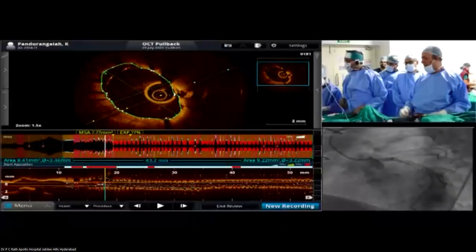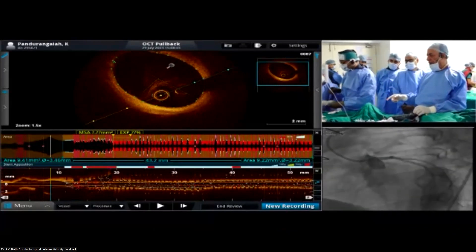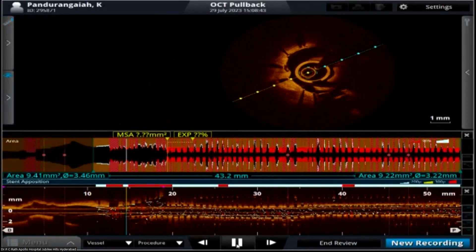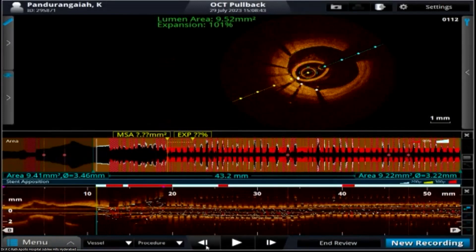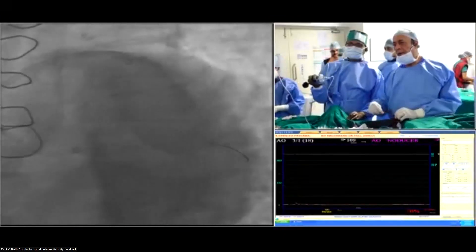Can you show the OCT imaging, please? We believe the patient was stable for this maneuver. In the OCT, you're saying the distal stent is nicely opposed, but just near the ostium, there is poor apposition. Just show the OCT image very clearly. We can see the distal part of the OCT coming back towards the ostium. The lumen is 10.